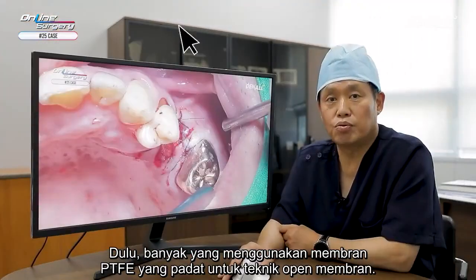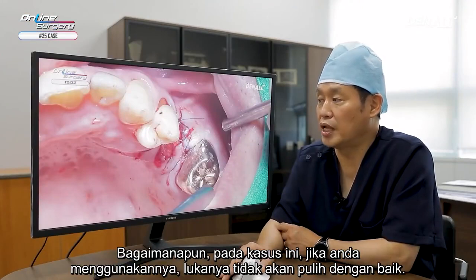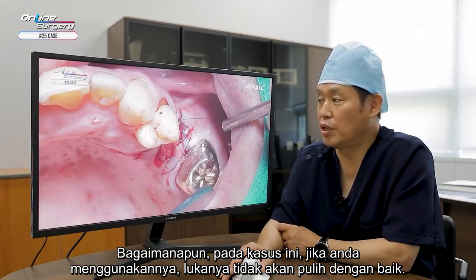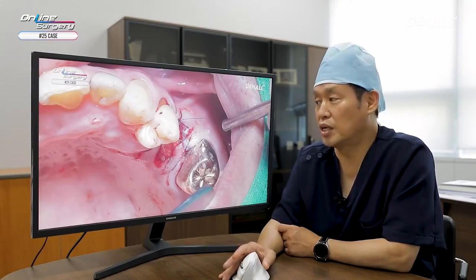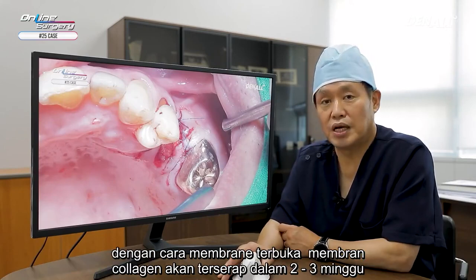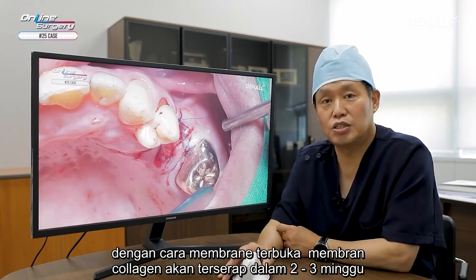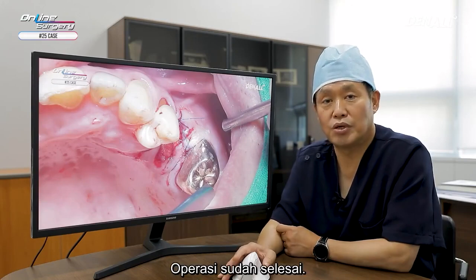In the past, people used dense PTFE membrane for the open membrane technique. However, in my case, if you use that, the wound did not heal nicely. If you use collagen membrane instead and do suturing like this in an open membrane way, the collagen membrane will be resorbed in 2 to 3 weeks and the soft tissue will heal naturally. This was how the surgery was completed.